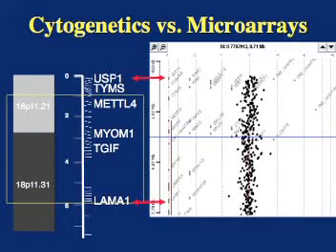Here is a comparison of the resolution of this technique relative to the other chromosome analysis techniques that we've discussed. The left half of this picture shows the same diagram you've seen before. It depicts the end of the P arm of chromosome 18. The yellow box indicates the smallest detectable change using cytogenetics. The white box on the right side is actual data from a microarray experiment from someone without a deletion of this region of the chromosome. So all the data points cluster around the zero axis.